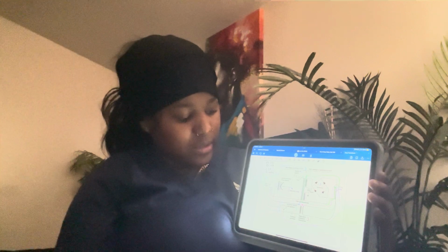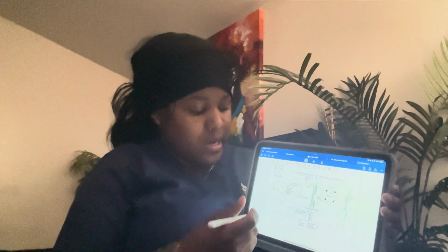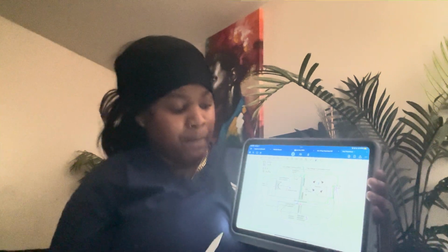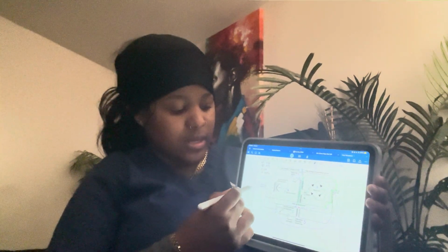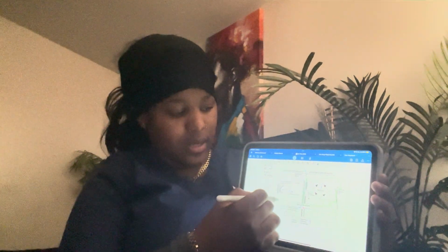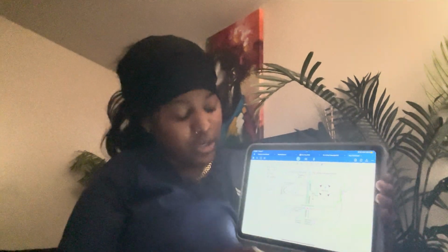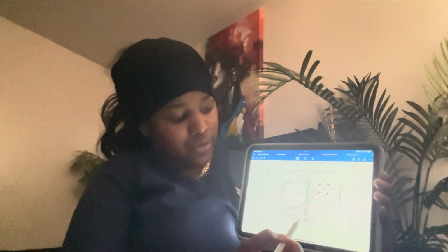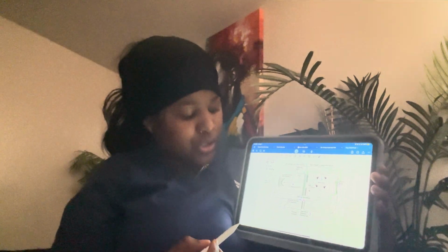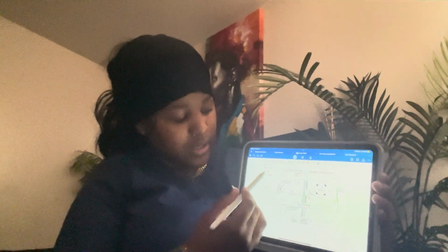So when utilizing it, you may wonder why we even use 220 volts. Why don't we use 330 volts? Well, there's not an actual specific reason, but it's normally because it's the standardized part of being able to utilize the auto transformer and the rest of the circuit, because there are many other components that happen to utilize boosting it and stepping it up and so forth.